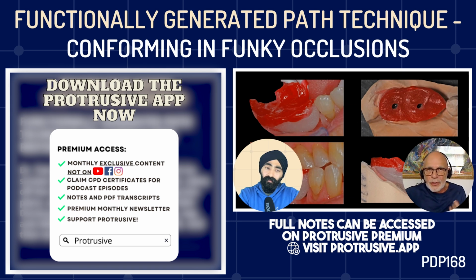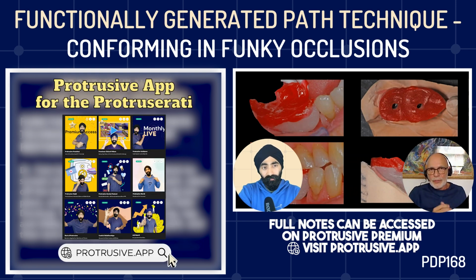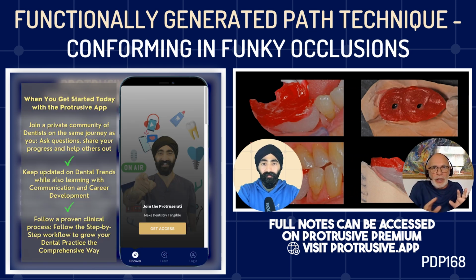Patient comes back, take off the healing abutments. I put the jig into place and do exactly the same thing with the Duralay. The patient taps up and down. I mean, that can be in a normal occlusion as well. Patient taps up and down, slides around, they generate the path, and you send that off to the technician. You let them finish it off however they want to, reshape it, and then they scan it and give you the restoration. And I've not had any major issues with the occlusion doing that.